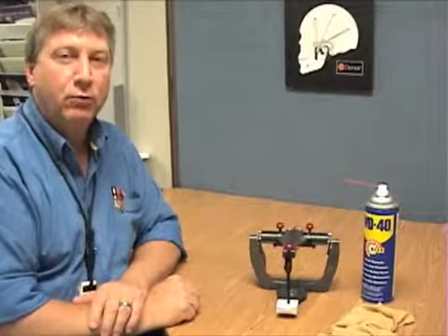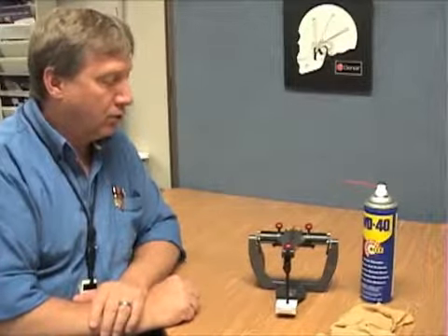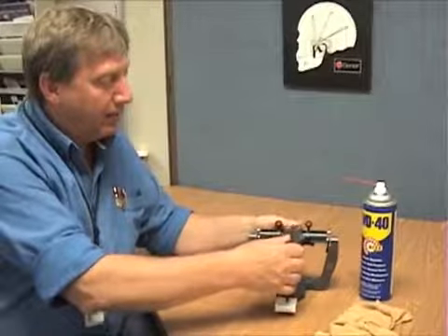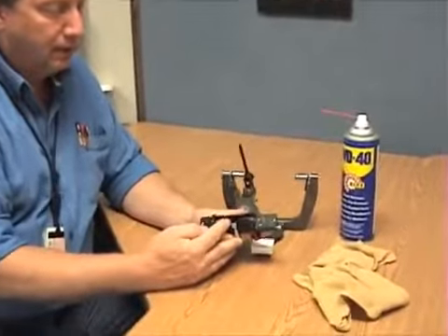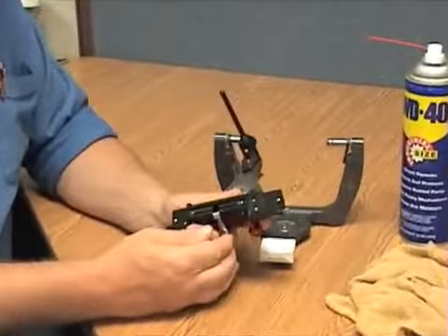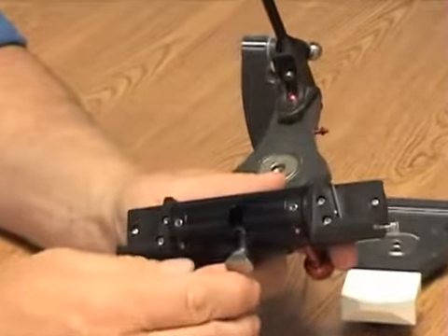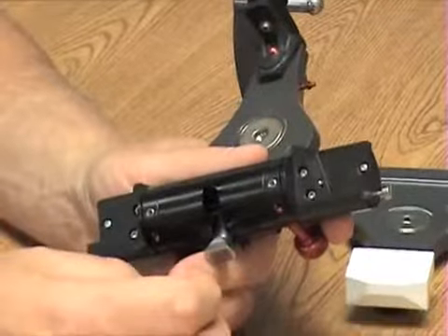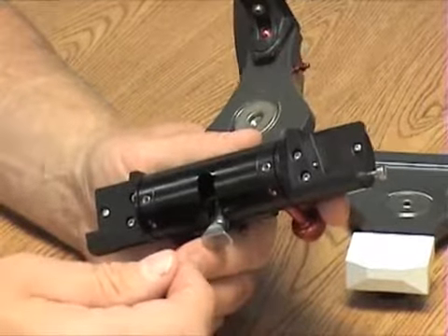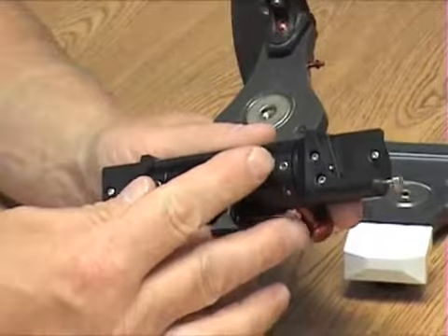In this segment we're going to talk about the importance and the need for lubrication of the 300 series articulator. As we start to step into that, I'm going to talk a little bit about the mechanism in the latching system. No different than the ball joints on your car, they have metal on metal working surfaces, and it's very important for those surfaces to have lubrication. Inside here we have the same thing happening.